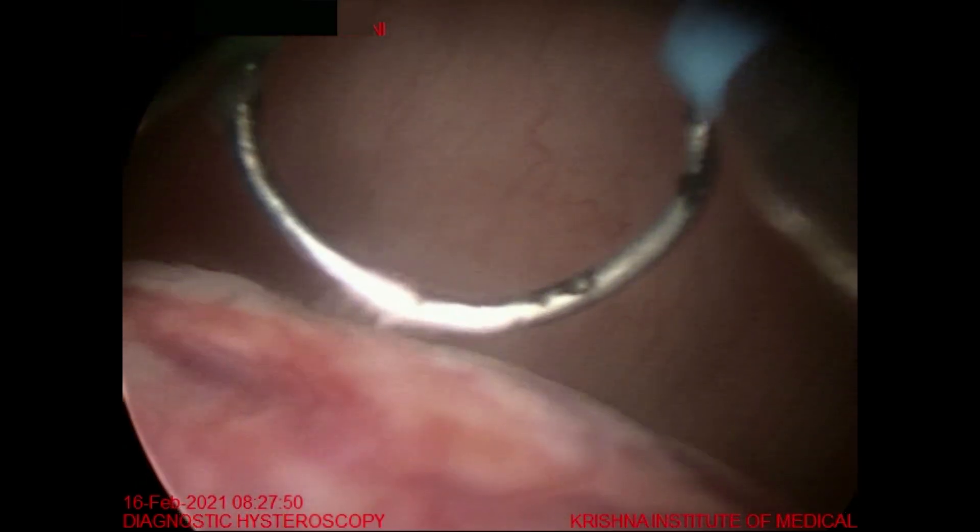Now to see the right ostia we have to turn the light cable to the opposite direction. Now you can see the right ostia. This is the fibroid arising from the posterior wall of the uterus, so it is a type 1 submucous fibroid. You can see the broad base of this fibroid arising totally from the posterior wall. This is the base of the fibroid and this is the apex of the fibroid.